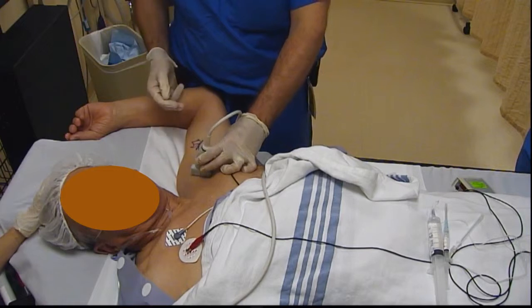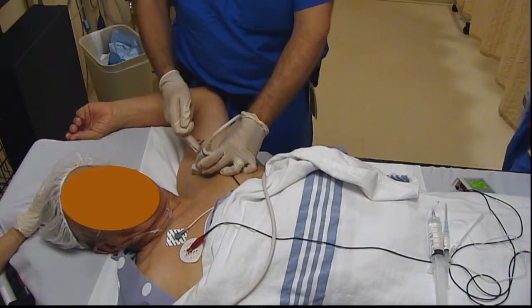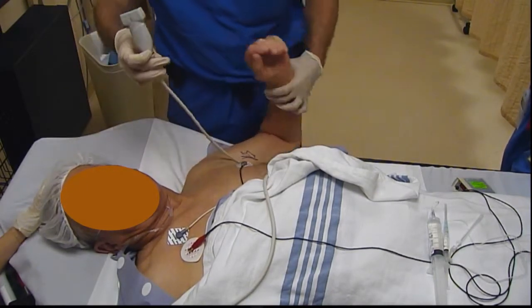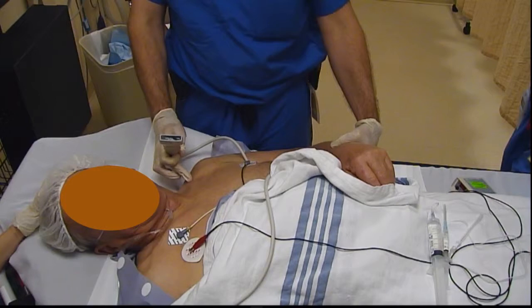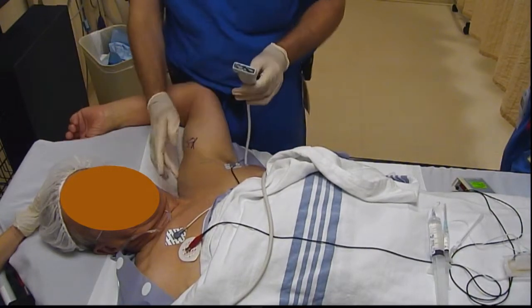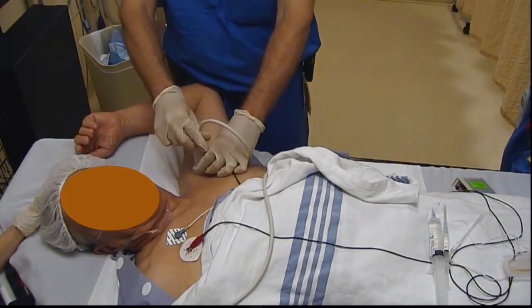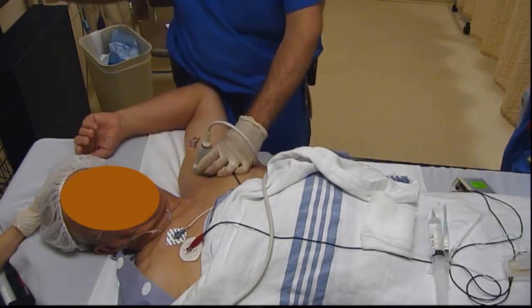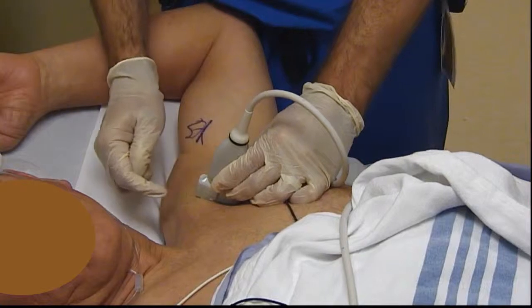Taking a zoomed-back-out look again, probably more importantly described as the first of the three elements is the arm position change. We call this the Houdini clavicle position because if you leave the arm at the side in a neutral position like we do for supraclavicular blocks, the clavicle is essentially in the way and you're not able to insert the needle very far from the probe, and therefore you're not going to visualize the needle very well. The simple repositioning of the arm over the head displaces the clavicle so it's no longer in the expected needle path, and you're able to take your probe, rock towards the needle insertion, and insert the needle farther away from the probe.